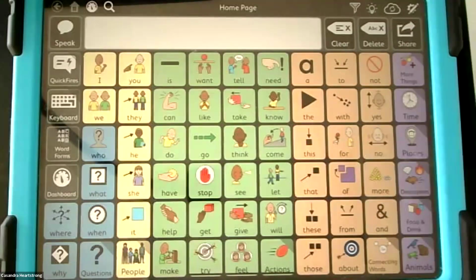It's in yellow, just like on Touch Chat Word Power. Do you notice where on the screen, right, left, middle, the pronouns are on? They're on that left side, just like Touch Chat Word Power. What color are the verbs, the action words? They're in green too. They're also in the middle because that's where they go in a sentence. So again, just made for language and literacy development.